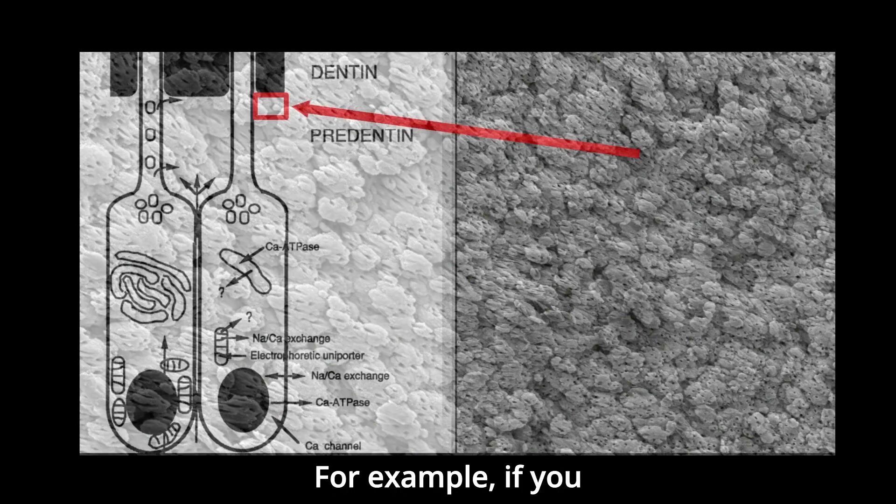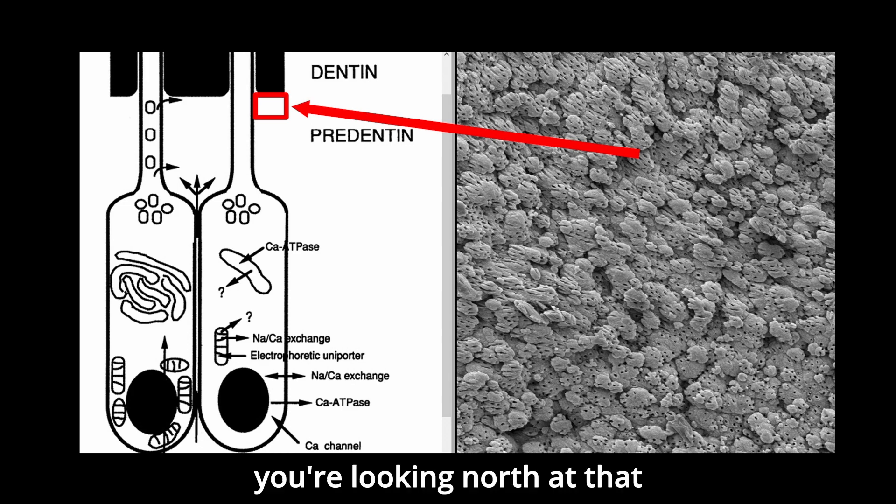For example, if you look at my arrow here, you're looking north at that mineralization front, right at the level where the pre-dentin is partially calcified, and the pre-dentin south of that is gone.